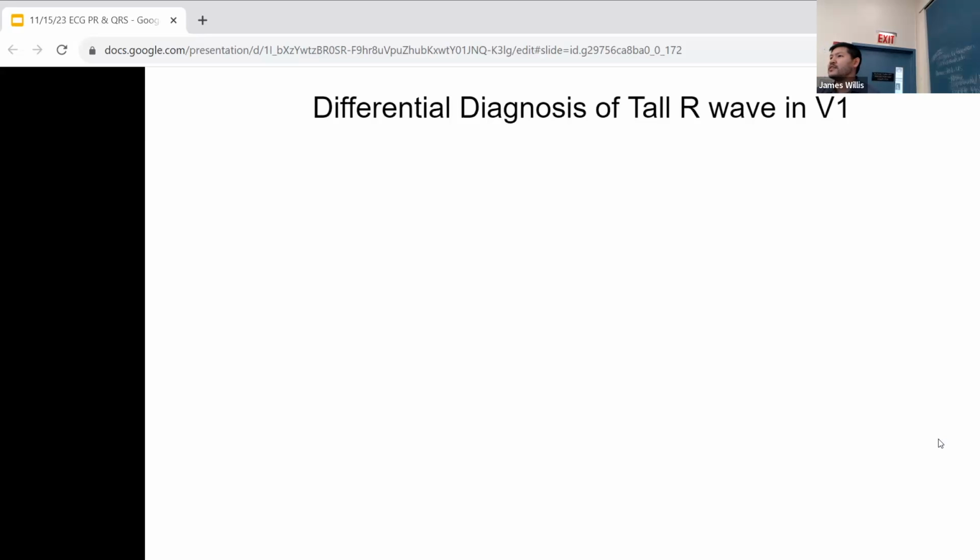What else? Pulmonary hypertension causing right ventricular hypertrophy or strain. What else? One more important one, really important one, where the R is bigger than the S in V1 and V2. We've gone over this so often. Dr. Senna says posterior wall MI.